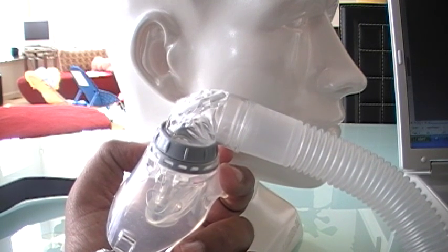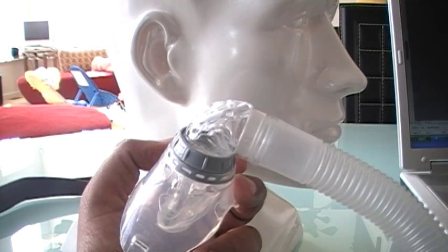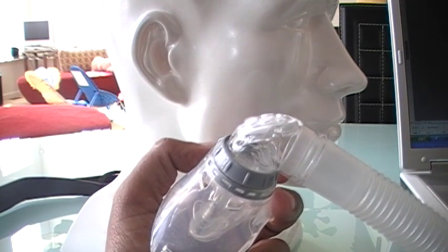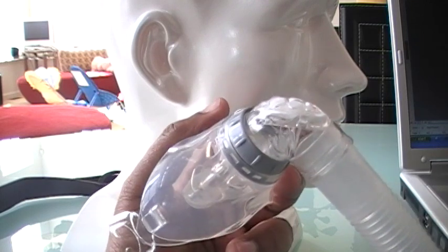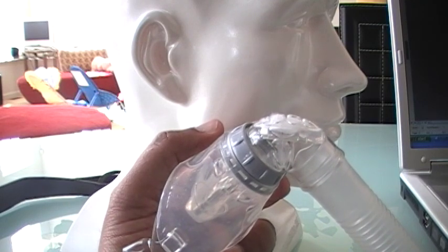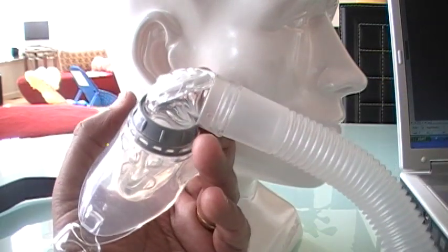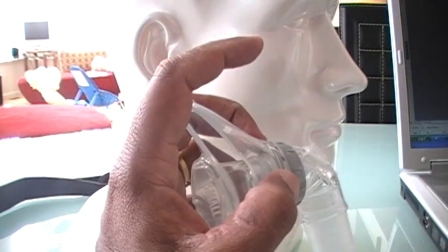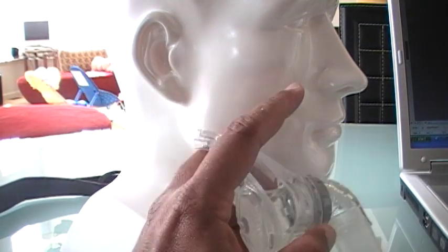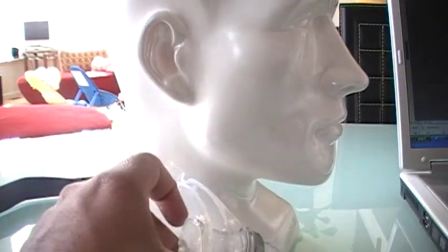One more thing: if you are suffering from Sjögren's syndrome or any other disorder that makes you susceptible to dryness — Sjögren's syndrome being a chronic autoimmune disease where a person's white blood cells attack the moisture-producing glands — please don't use this mask. It really is not going to be a good thing for you. Thank you for visiting cpaphelpdesk.com. This is the Oracle 452 made by Fisher and Paykel.